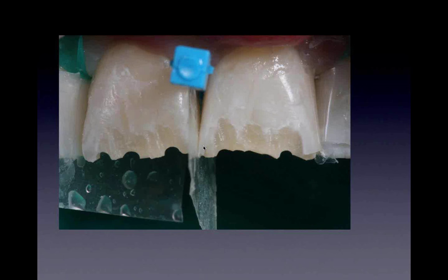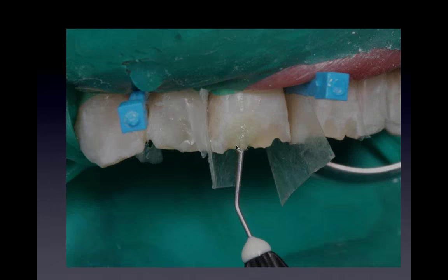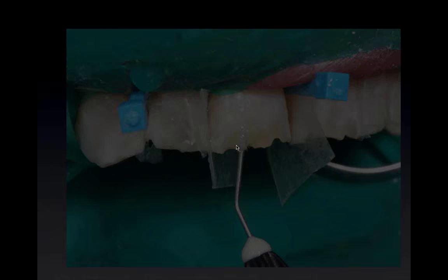So that's isolated. Here's the anterior. Once we finish the posteriors, I mean the laterals and canines, we go ahead and try to recreate the mamelons that he had in the original teeth. So we'll prepare this facially and again lingually, so we're wrapping around the whole tooth with that bonding. We're not just adding the edge. That gives it a lot more strength and a lot more compression. So here's the dentin bond.